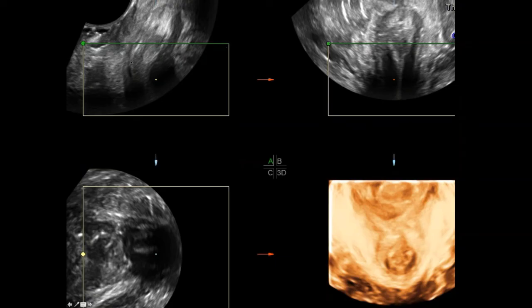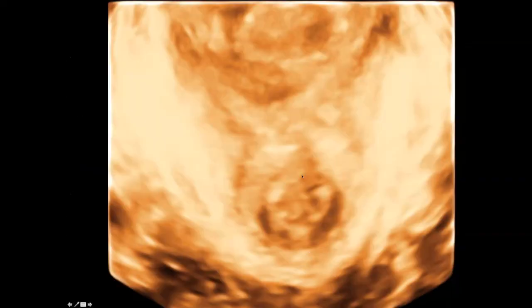And here we are trying to find it along the wall here. I'm looking up and down the wall of the vagina with the rectum, which is right there, and you can see here that we found pretty much where it was pointing, what level that was at, and we can certainly pinpoint it pretty well with 3D ultrasound, just going up and down and looking for where the defect is. Here again is the defect right here into the vagina.